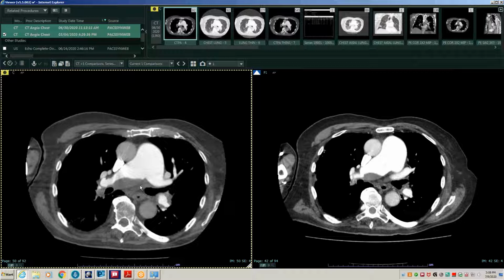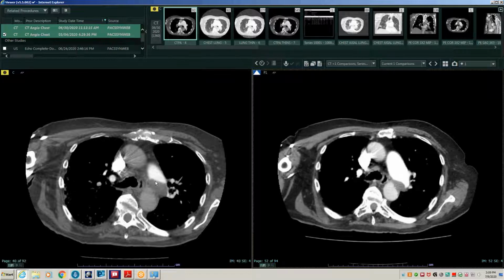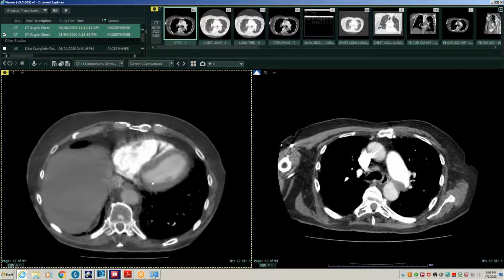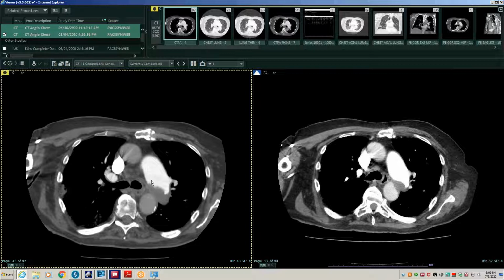It's not PAH. I don't think it's PAH related thrombus. As in, this thrombus grows. Yeah, you get clot growing on clot, and especially your right lower lobe is out now. And we see this quite frequently, that it just gets bigger when not on anticoagulation. And if they go on anticoagulation, you'll be surprised how much of it still goes away, even though it's still layering chronic thrombus.